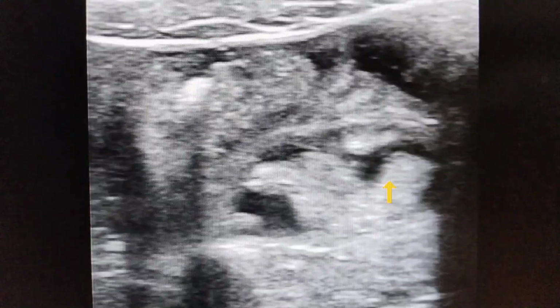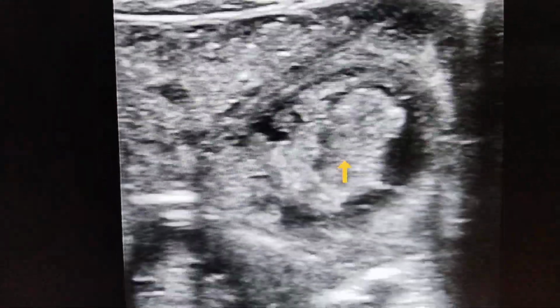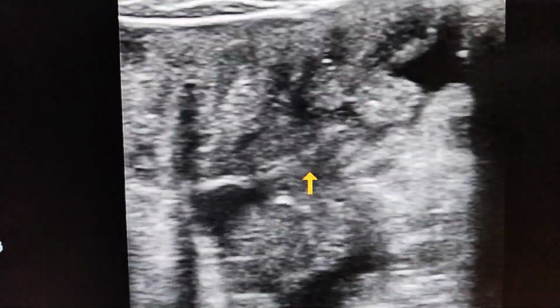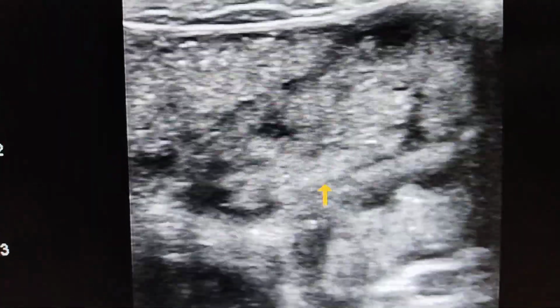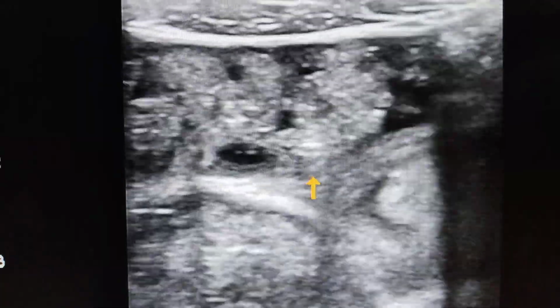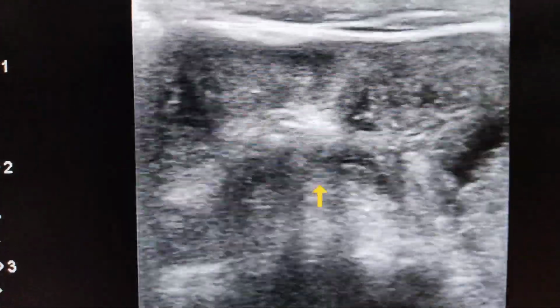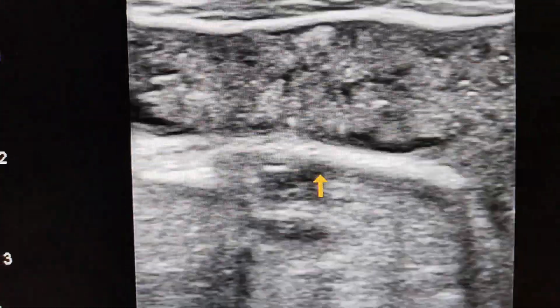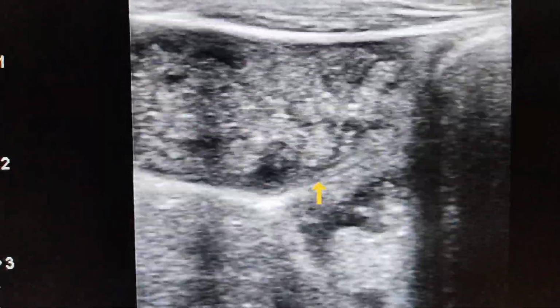Whenever such a child has such a history, and the small bowel is behaving like this with putrefied food particles within the lumen, acting like a washing machine, and also with bowel loops having significantly increased peristalsis, and the lymph nodes also may be present, such cases are intestinal malabsorption.